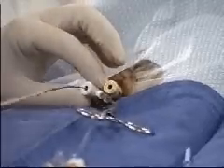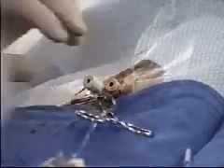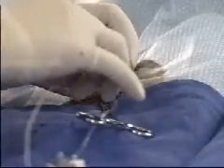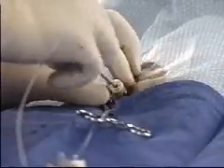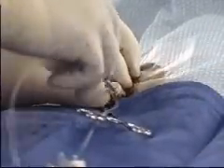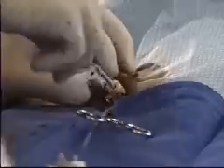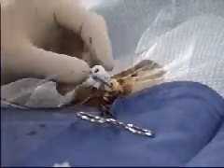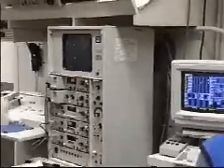This procedure starts with the introduction of a long plastic catheter into a large artery in the groin. The catheter is threaded up to the heart via the largest artery in the body, the aorta. Close cardiac monitoring is routine during cardiac catheterization.